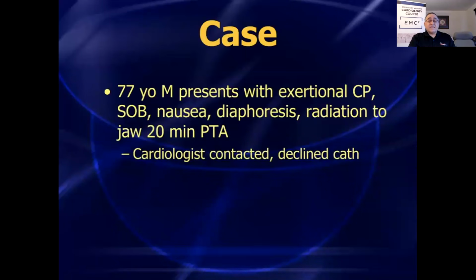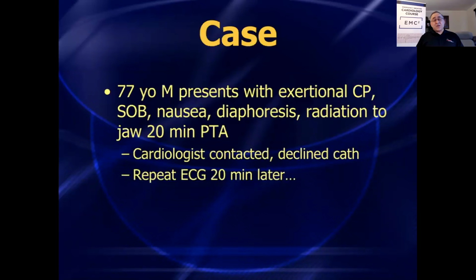Well, they tried contacting the cath team. Cardiology said no, because I don't see ST elevation in contiguous leads. I would probably get the same pushback at my hospital. They declined the cath. So what are you going to do? Well, easy. You're going to get repeat EKGs. You're going to stay on top of the patient, give them aspirin. If you're really worried, you can give them some heparin, give them your clopidogrel or ticagrelor, or whatever your hospital protocol is. But you stay on top of the patient, get serial EKGs.